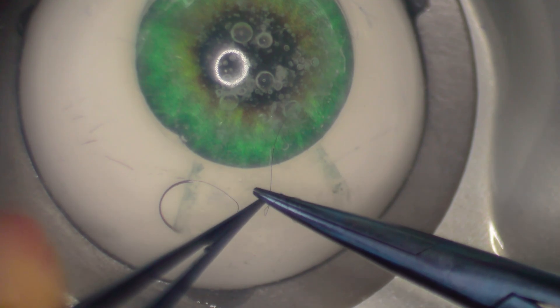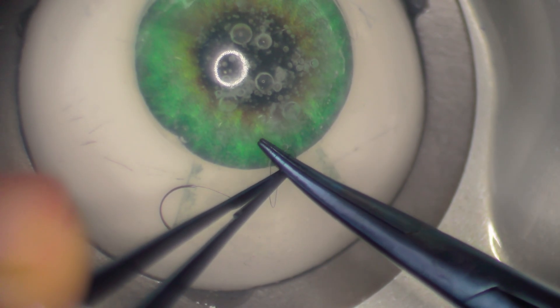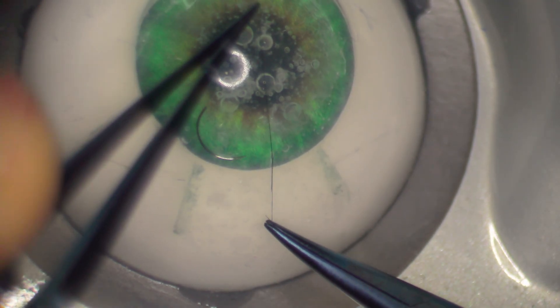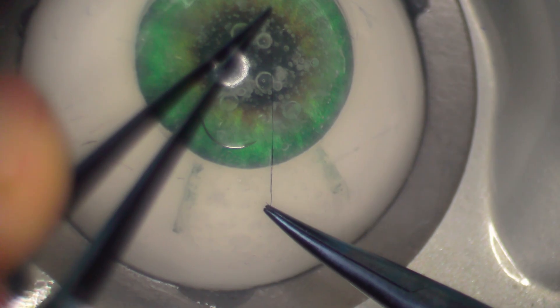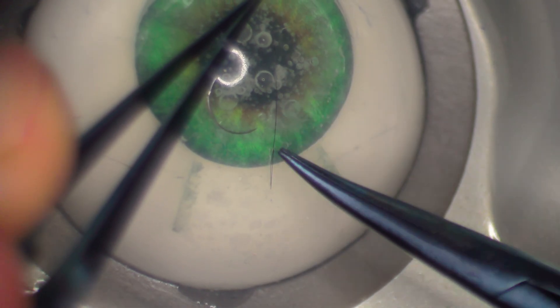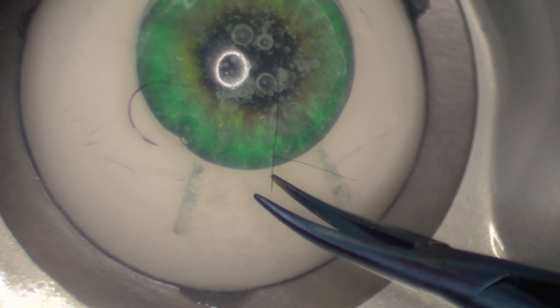Step seven: do three throws around the needle driver and grab the short end and pull it through. Notice that the knot loosens if you leave it like this. That's why you need to cinch it — this makes it keep the tension. You can always loosen it again if needed.